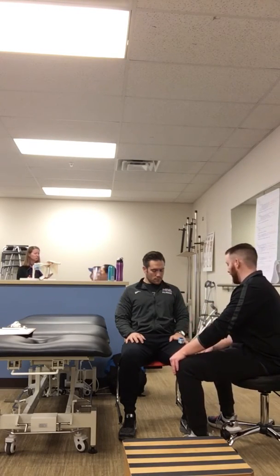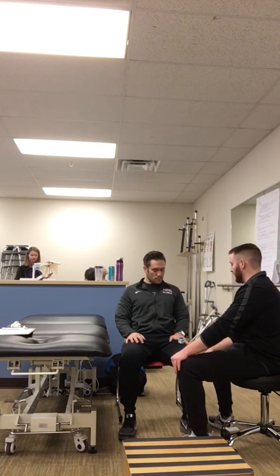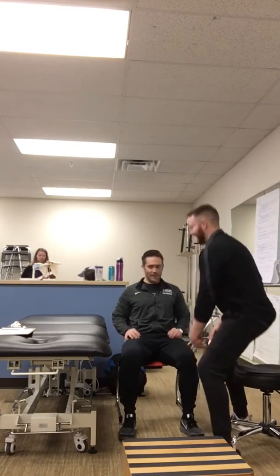So again, I'd be monitoring the respiratory rate one more time for a minute. Oxygen is coming back up, it's at 94. So I'd say continue to focus on your breathing. And heart rate is down to 74, so kind of back to where you normally would be. 72.